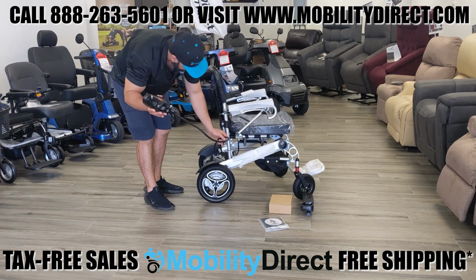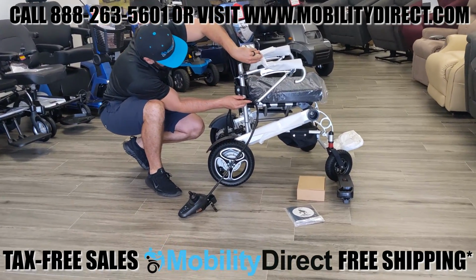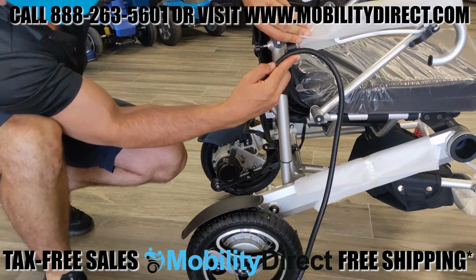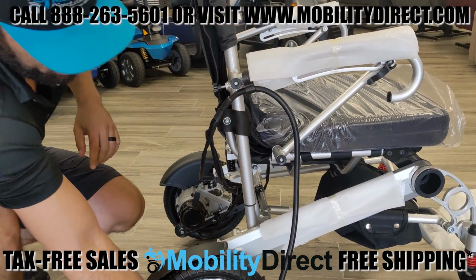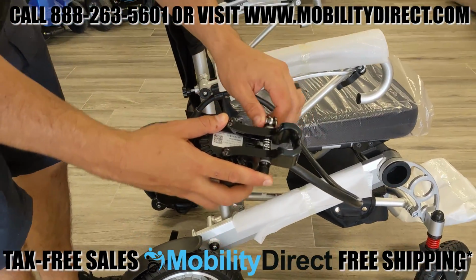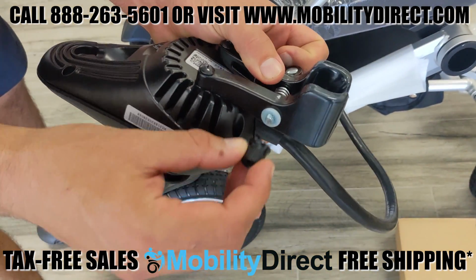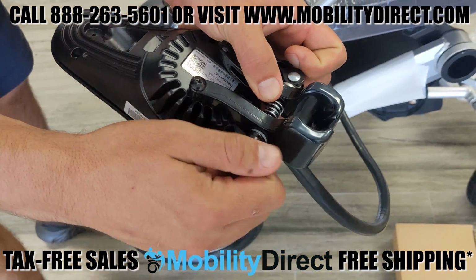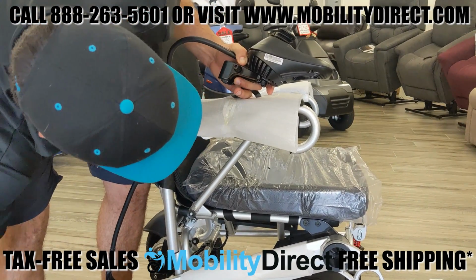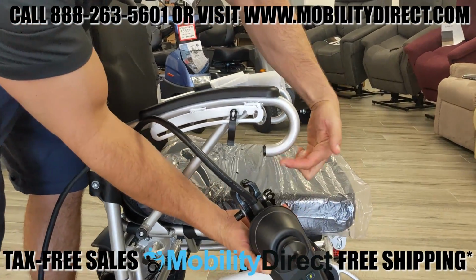What you want to do is make sure that the main cable for the joystick controller is free, and then locate the little harness for that main joystick cable. It's located at the rear side of the right armrest. Once you have that main cable attached to the harness as shown, we're going to show you how to install the joystick. It comes with a bicycle style clamp. Be careful when you're loosening that clamp. The little twist knob on the right side will come off as shown, and then go ahead and just remove that styrofoam wrap around the armrest so that you can work with the joystick controller a little bit easier.